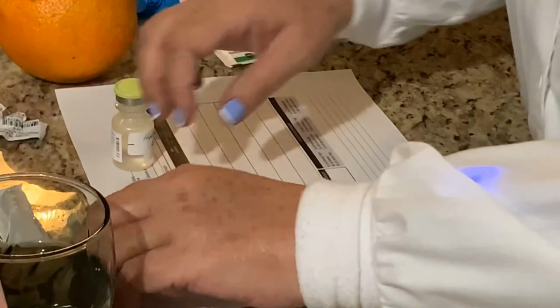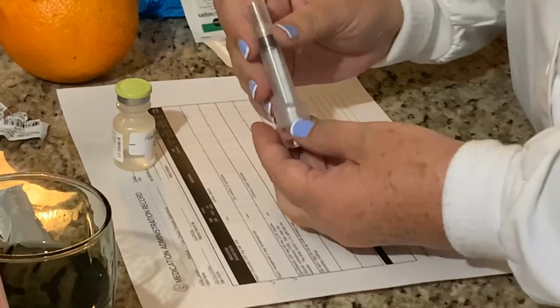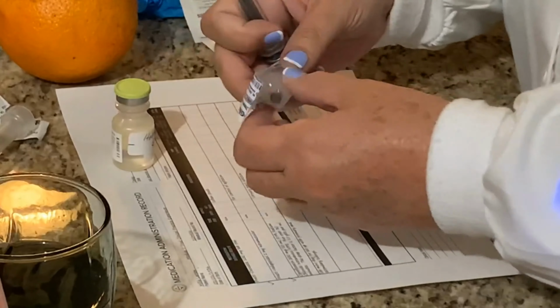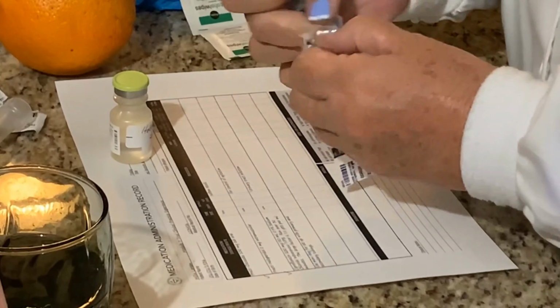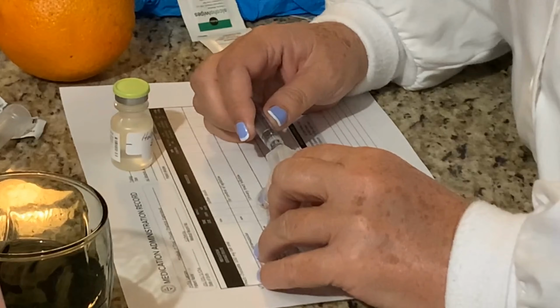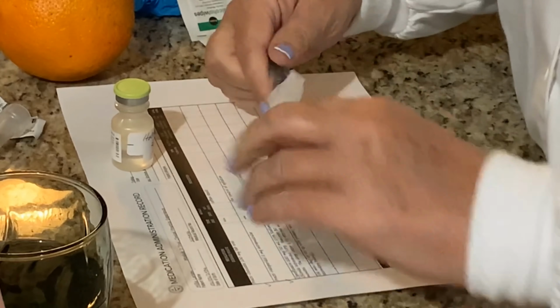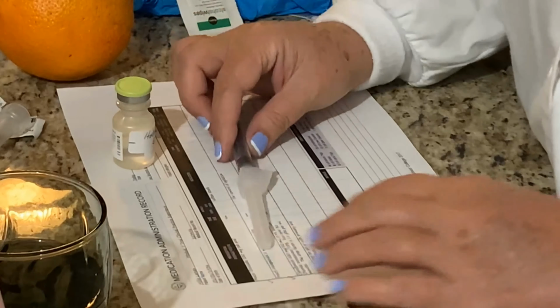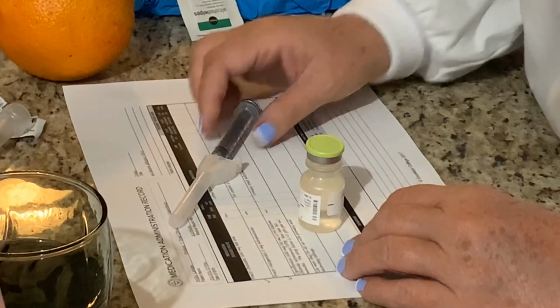So now I'm going to open my needle, and I'm going to be very careful not to contaminate this, because that right there is sterile. I'm going to open it very carefully and connect it without touching it. Now once it's covered, you can set it down as long as it's covered. So now I'm going to draw up this medication.